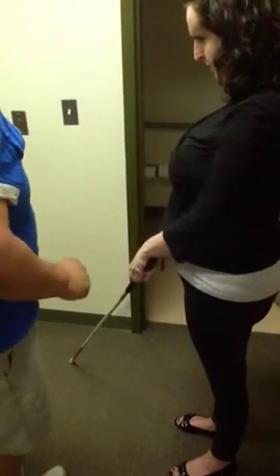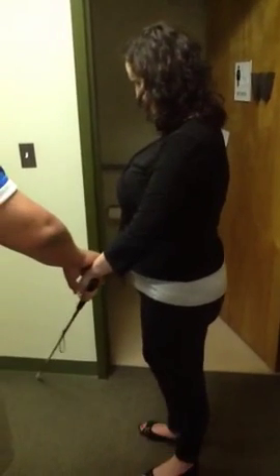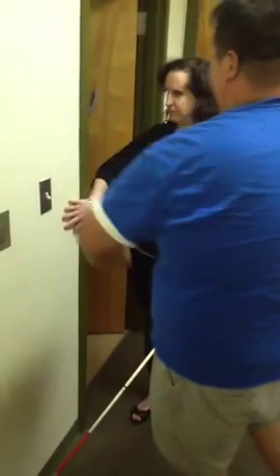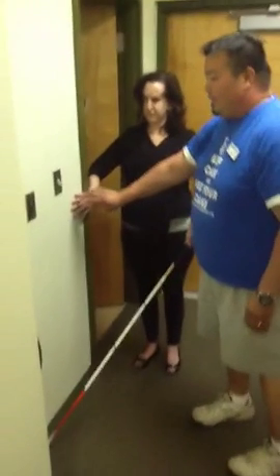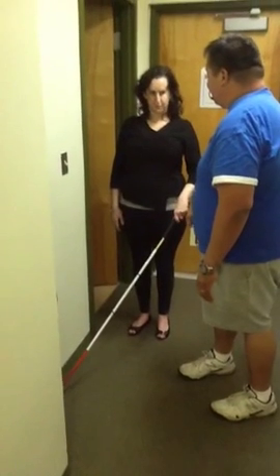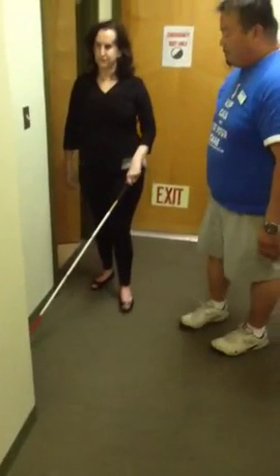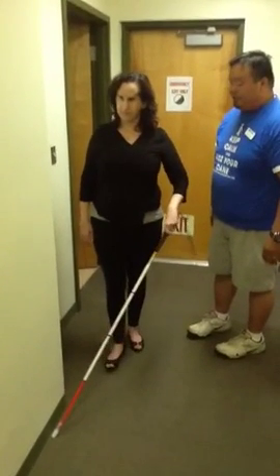Okay, what you're going to do is find the wall. So get a little closer to the wall, a little closer, so you can actually feel for the wall. Just get a little closer to the wall so you're not in the middle of the wall. I know this is a bad place because there's a doorway here, but we'll get around the door. What you're going to do is now put your hand down. You can trail the wall if you would like to trail it, but you wouldn't need to. Now you're just going to walk straight. Okay, follow the wall. Take a step out if you need to take a step out.